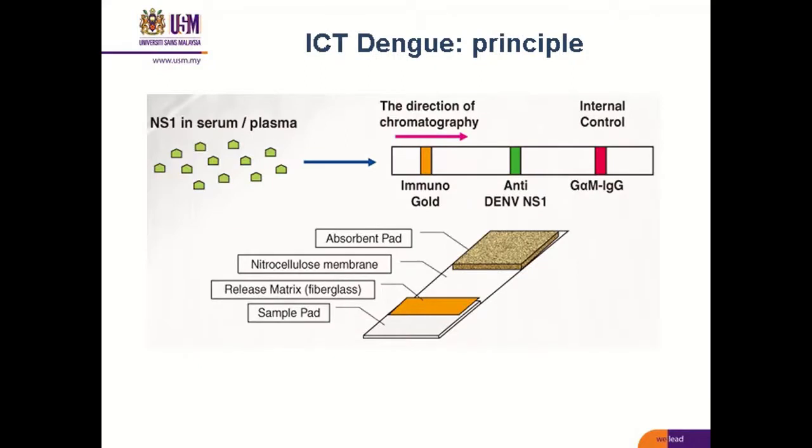So the principle is that when the patient sample is put in the sample pad, there is capillary action which pulls the sample through the test kit.